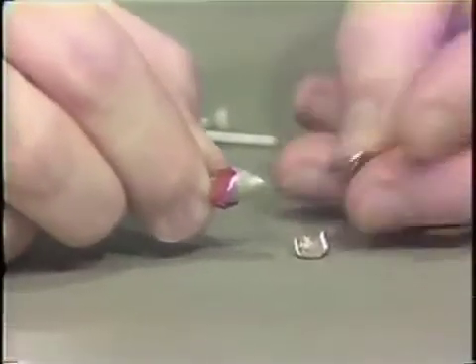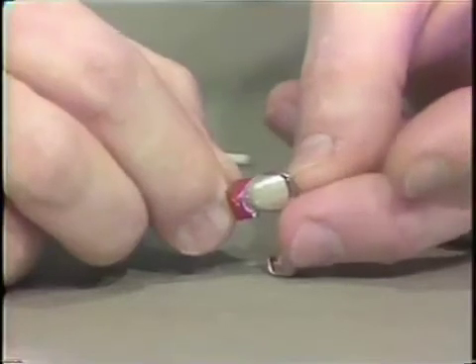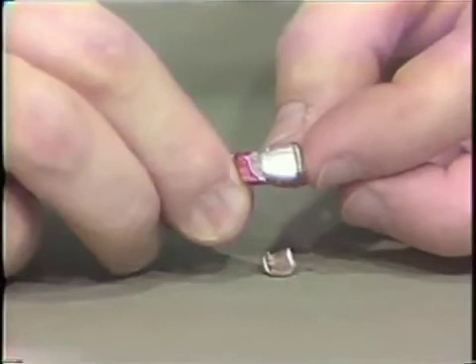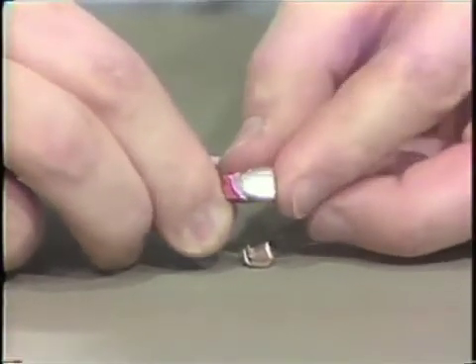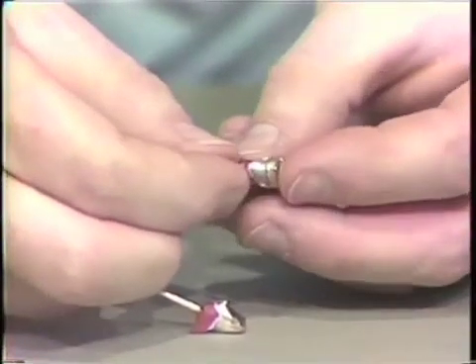The castings are then tried on the individual silver dies. They are carefully seated without a whole lot of pressure. When they are seated, the margins are examined. The cuspid casting is also tried on, and the margins are checked.